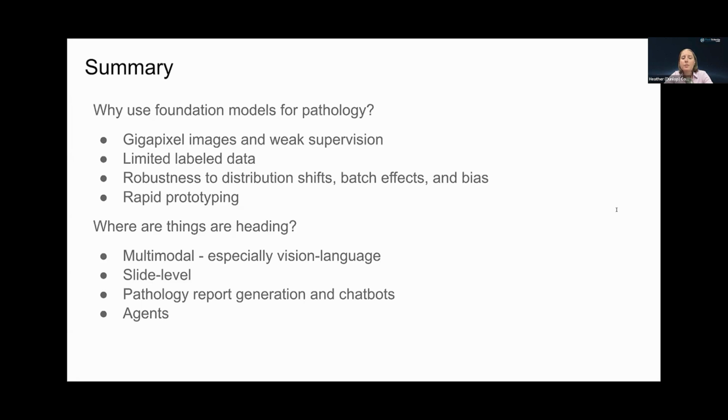For most situations, you don't need to build your own foundation model now. Somebody else is already doing it for you. And there's also Proscia's platform that is used to easily use the embeddings from slides.